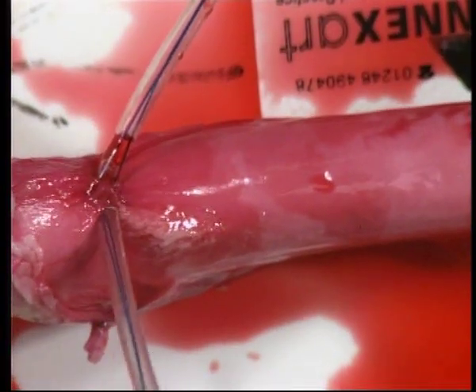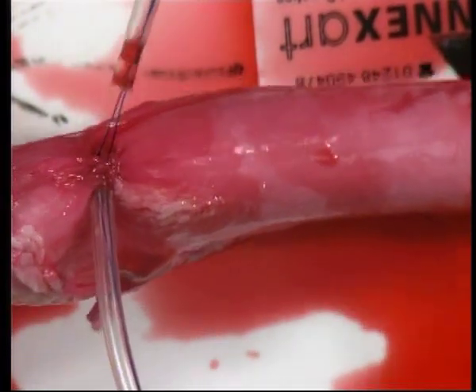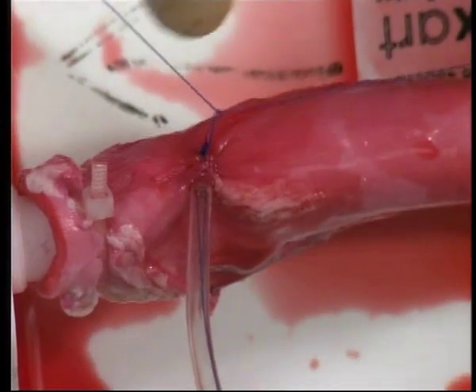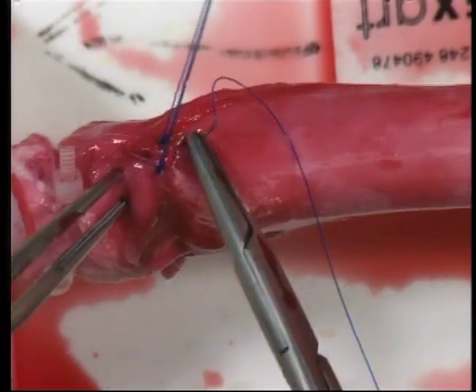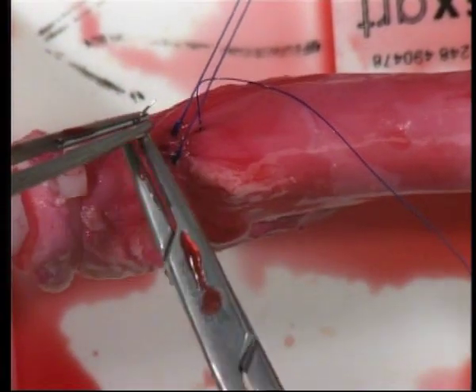Snug down on your side to achieve haemostasis. Once this has been done, the sutures can be tied. A full thickness mattress suture is used to underrun the secured purse string and control the aortic intima.